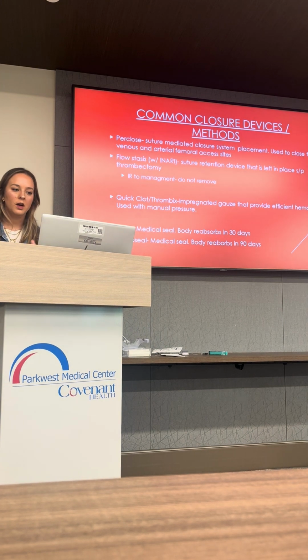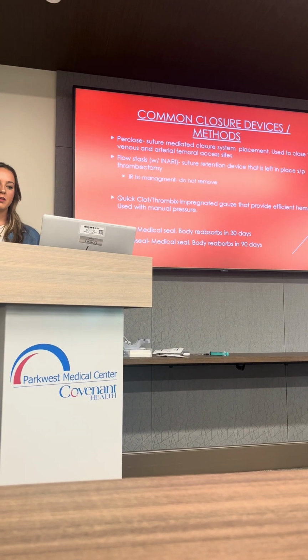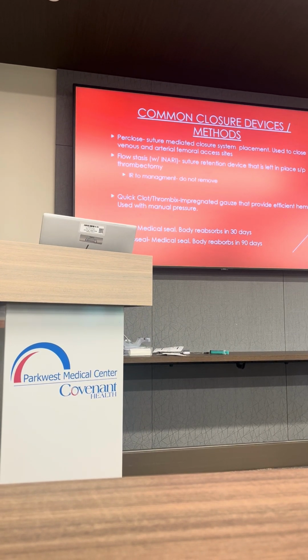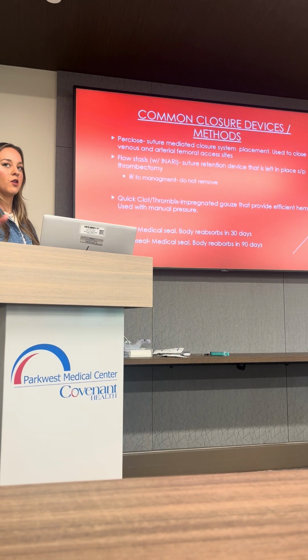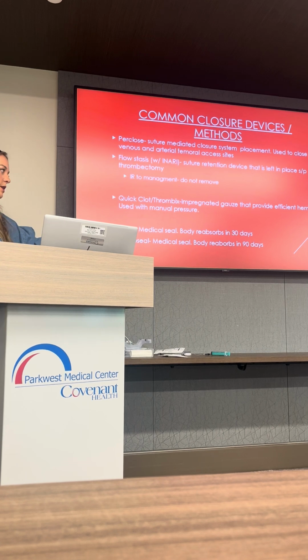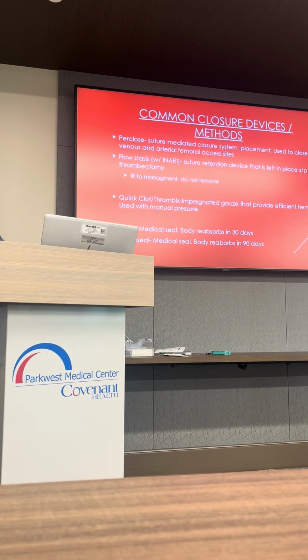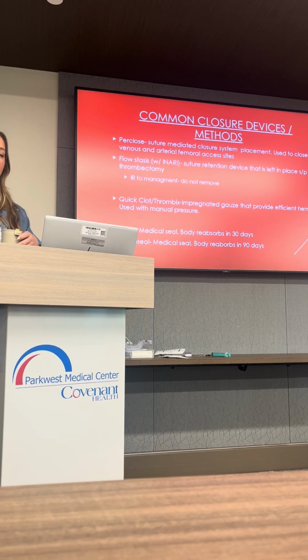All right, so again, we'll talk a little bit more about just some different closure devices or methods that have been used. I've already touched on a few of them, and a few of them we've really not seen in quite some time. So the ones that are not very common that we often don't see anymore are the two at the bottom, Minx and AngioSeal. I truly couldn't tell you the last time I've seen either of them used in our facility. And on the handful of times that I have seen it, it's probably been less than 5 that we'd actually use those.